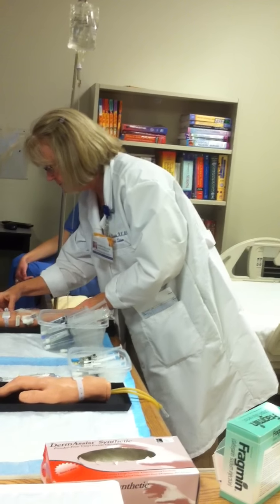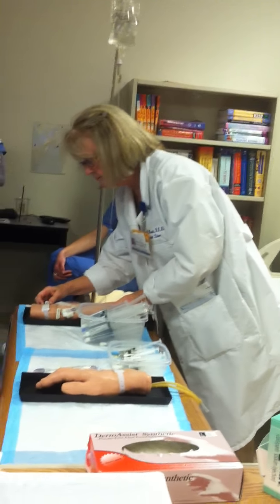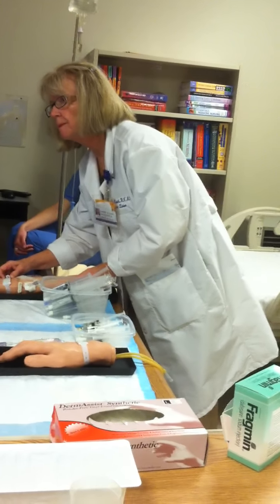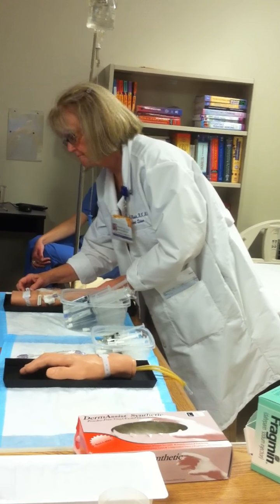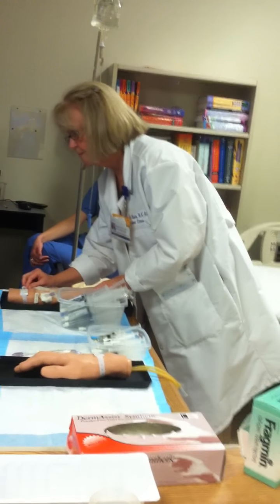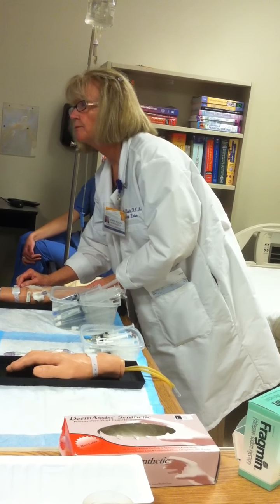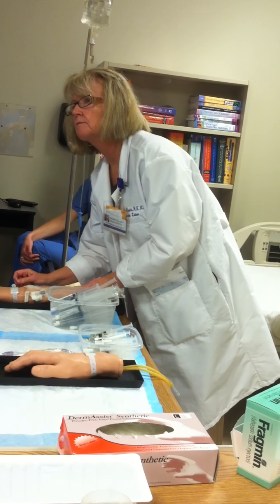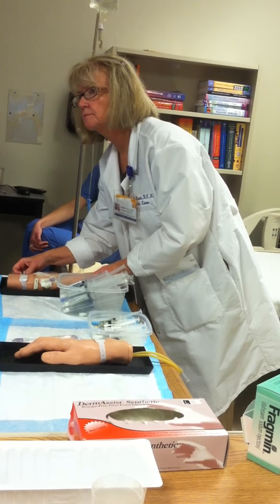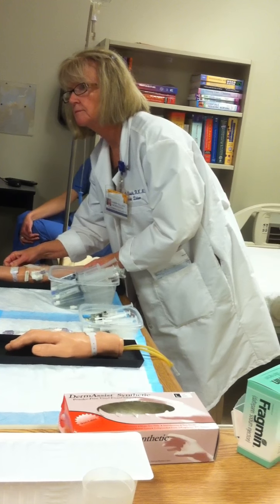The patient should be identified using two methods. Compare information with the CMAR or MAR. Check the name and identification number on the patient's identification band. Ask the patient to state his or her name and birth date based on facility policy. If the patient cannot identify him or herself, verify the patient's ID with a staff member who knows the patient for the second source.